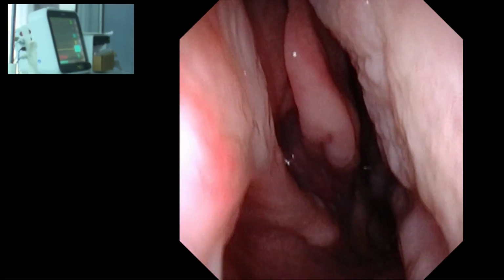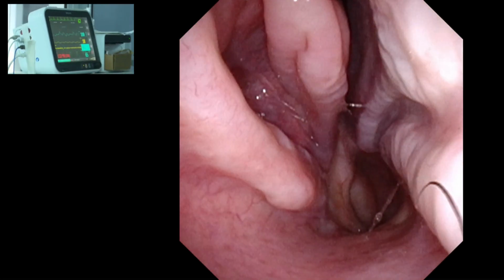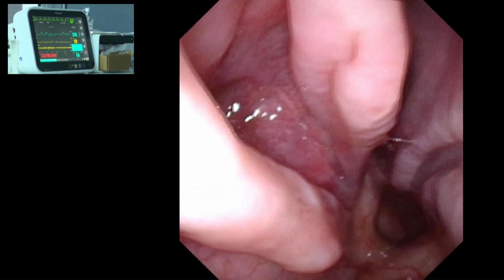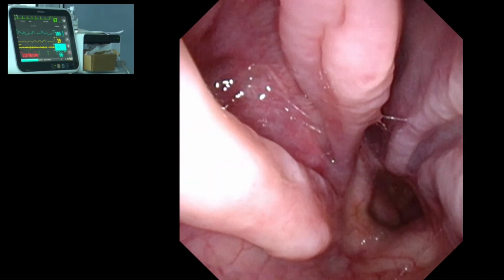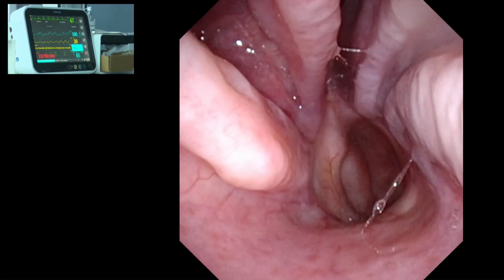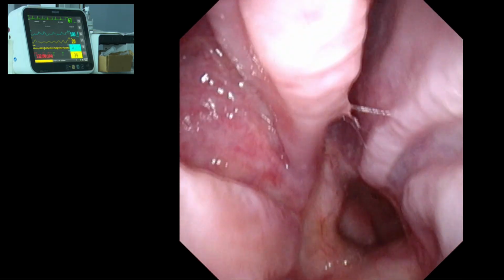So basically, the nasal pack is to decongest the turbinate and give a little bit of anesthesia, so that the patient won't get up while being stimulated with the endoscope. I'm using a nasopharyngoscope, Olympus 2.4 mm. It doesn't have a suction channel, but I'm using it. I'm standing on the right side of the patient.